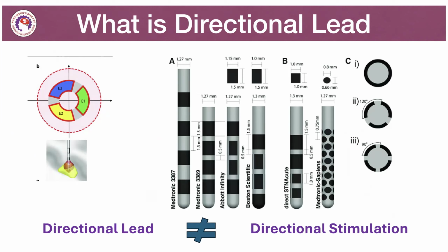You also have electrodes with different levels of contacts, or even quadri-segmented leads. But remember that just having a directional lead is not equivalent to directional stimulation. It's just putting a lead there. Directional stimulation is the whole process of what you are doing down there.